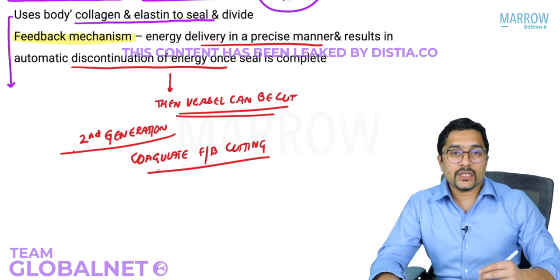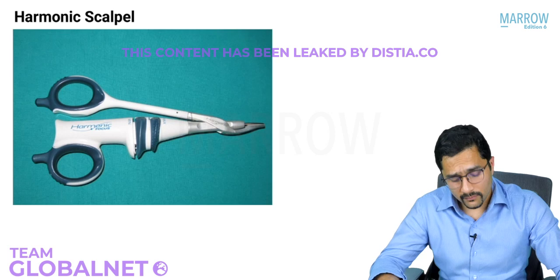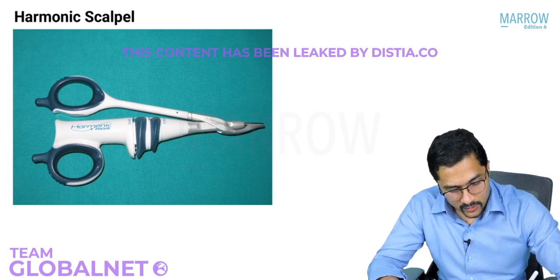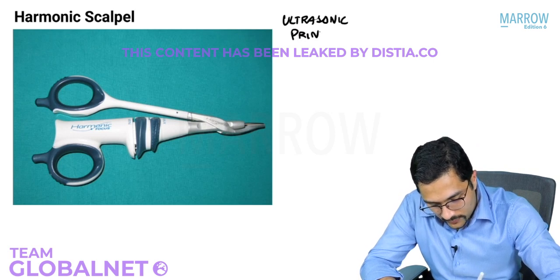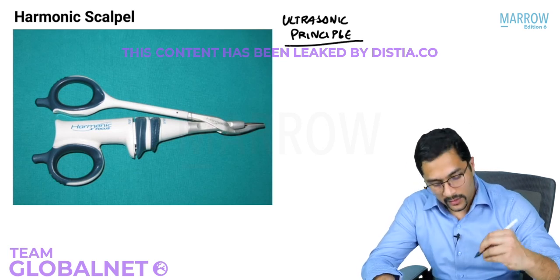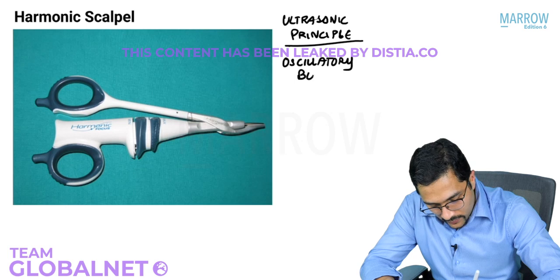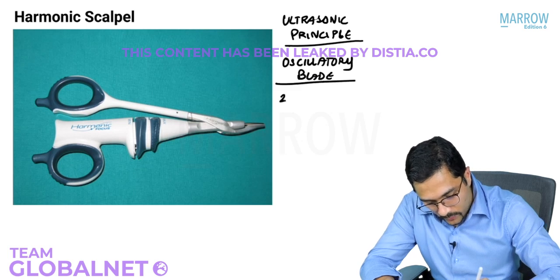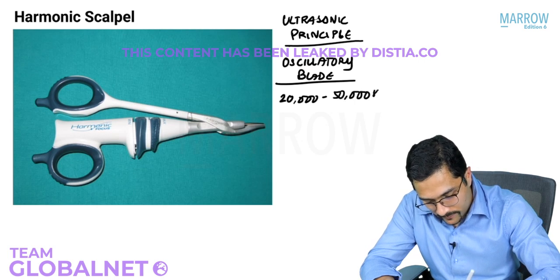Now another energy source from which lots of questions have been asked is the harmonic scalpel. Now the harmonic scalpel works on the ultrasonic principle. So what is the ultrasonic principle? This has an oscillatory blade which oscillates between 20,000 to 50,000 hertz.